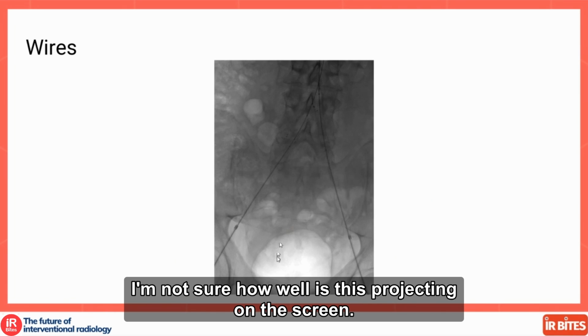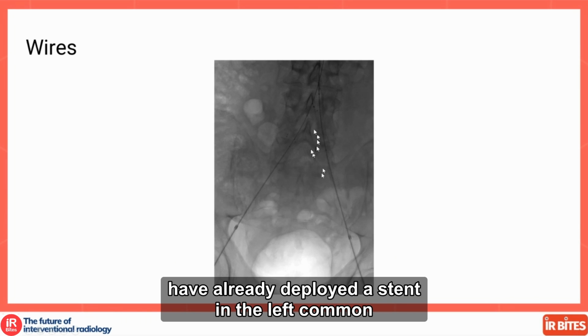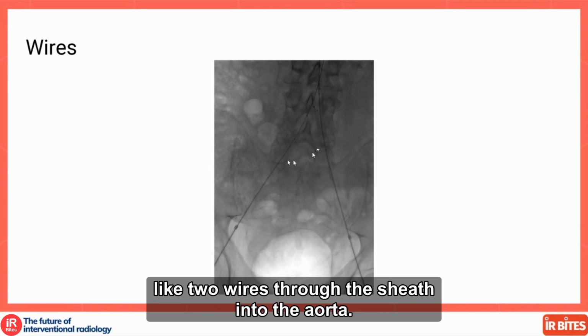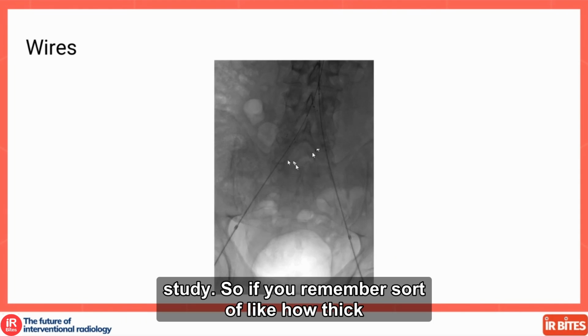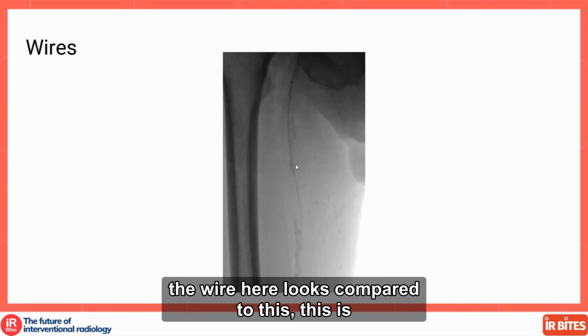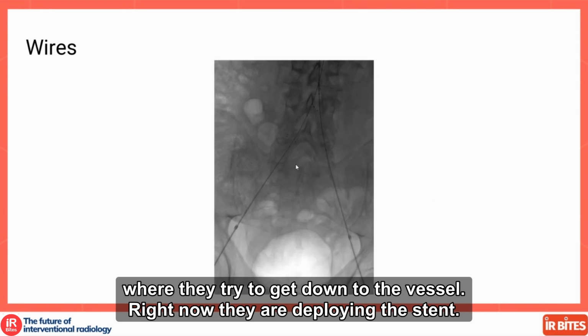And I'm not sure how well this is projecting on the screen, but can you see there is a stent there? They have already deployed a stent in the left common iliac artery. And you can see they put two wires through the sheath into the aorta. I'll just quickly jump back to the previous study. If you remember how thick the wire looks there compared to this, this is obviously a much thinner wire. This is like a manoeuvre wire where they try to get down to the vessel.